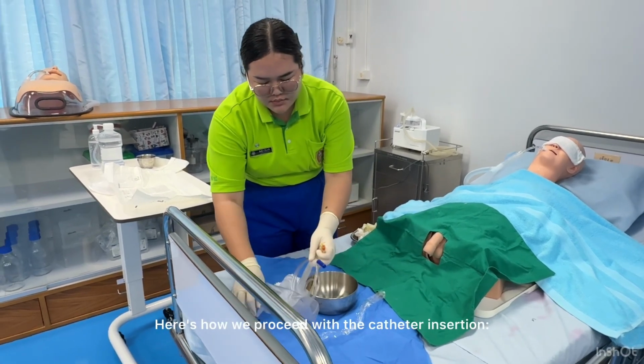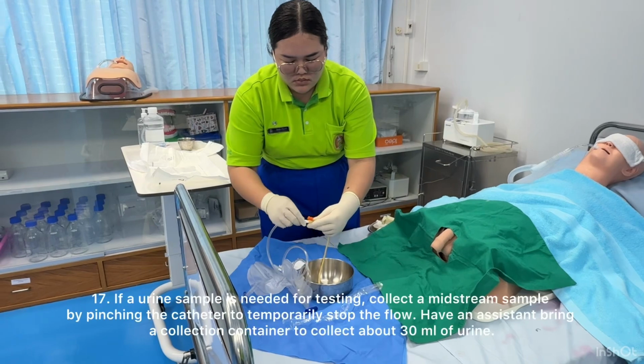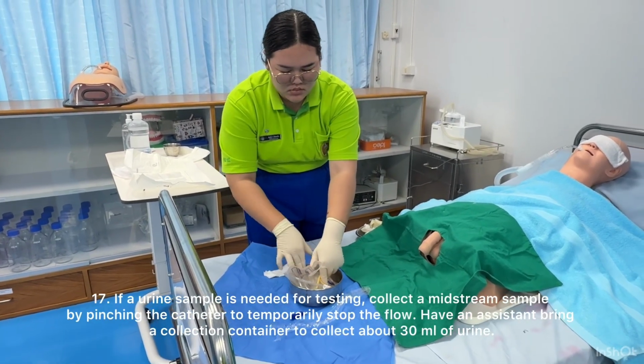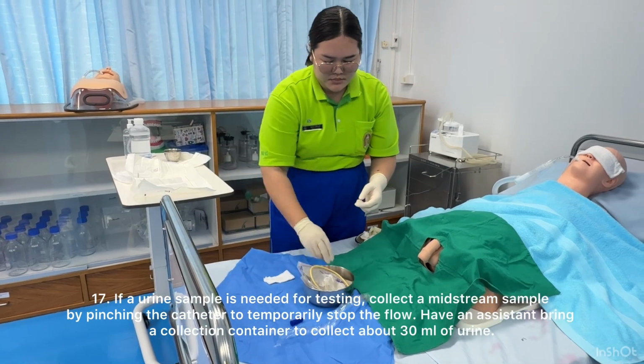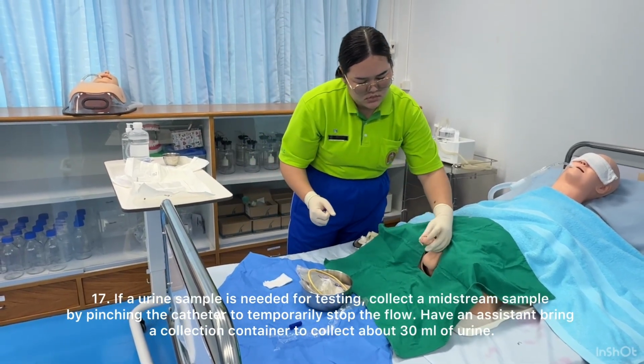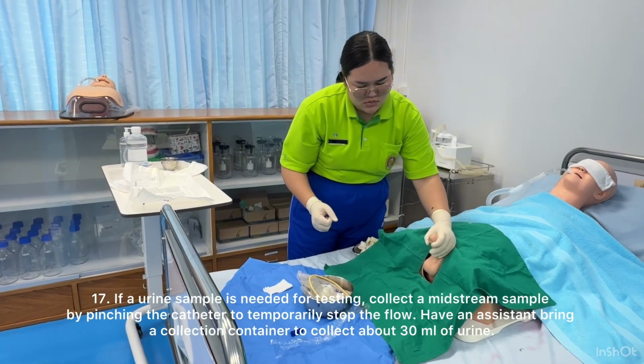Here's how we proceed with the catheter insertion. 17. If a urine sample is needed for testing, collect a midstream sample by pinching the catheter to temporarily stop the flow. Have an assistant bring a collection container to collect about 30 milliliters of urine.